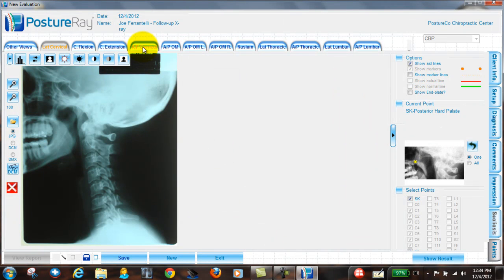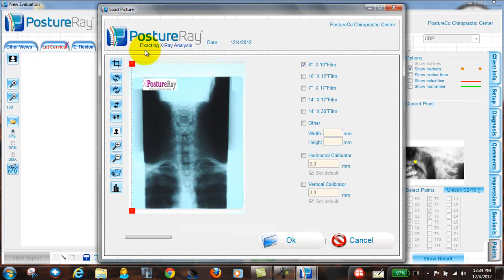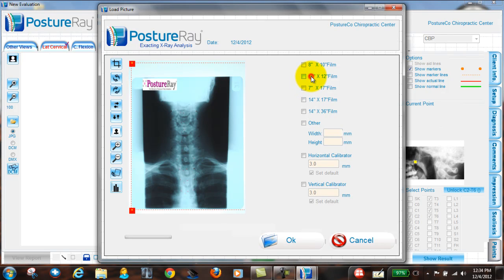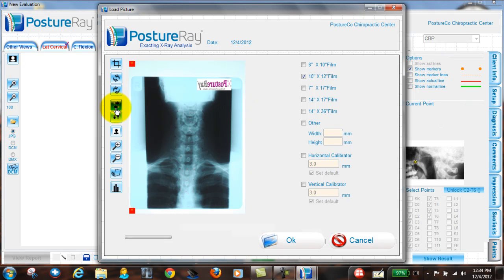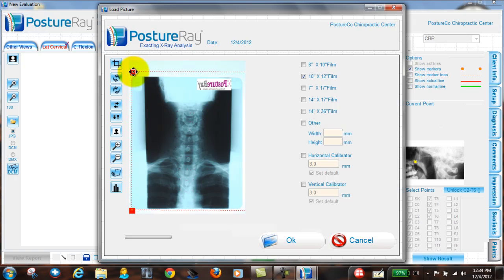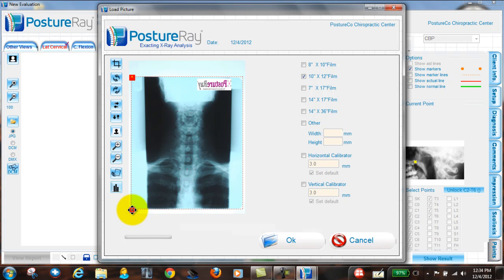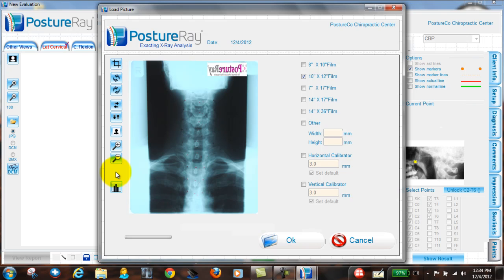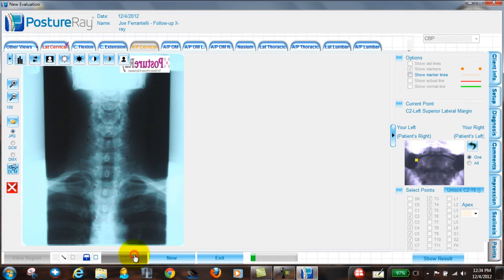And if I go to the AP cervical, same thing. So this is a 10x12. I just happen to know that, and I know that this is the right side. So what did I tell you? We want to make sure we view it the other way. Flip it for digitization. I want to crop down right like this to the X-ray, not the column, but rather the X-ray. So now once we have that done, we pull that in and then hit okay. And at that point, I've imported several films.